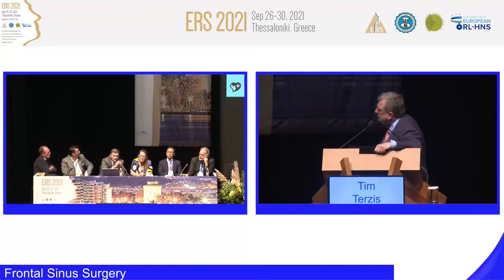I think in this case we need an incremental approach, and the decision will be made intraoperatively. So I will start to drain the frontal sinus, because this is a classical post-traumatic chronic frontal sinusitis, because you see also neo-osteogenesis, you see that the bone is also active, and this shows us that this is a long-term infection there. Yes, and of course he had the symptoms for at least 6 months. Yes, and I will try to do a type 2B, because I see over the septum to the other side, I see also a connection to the other side. So I think I will try to perform a type 2B, but the final decision will be made intraoperatively.